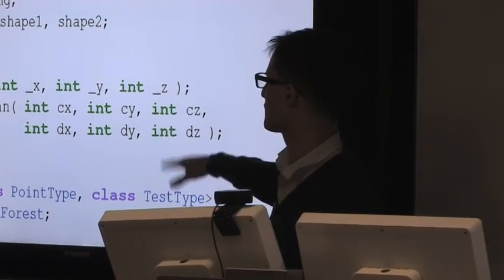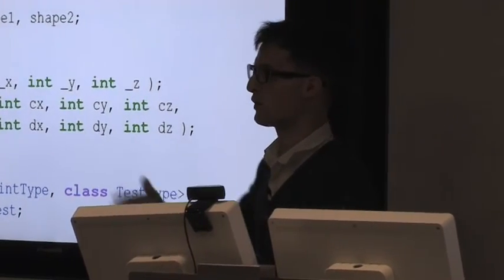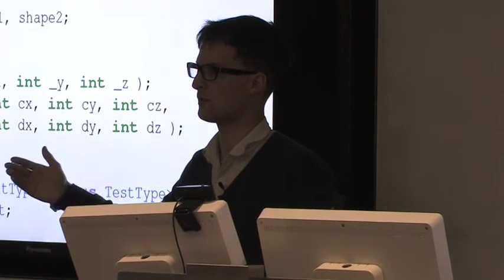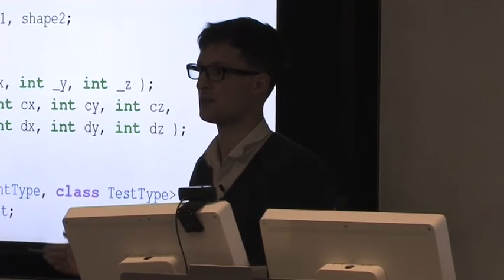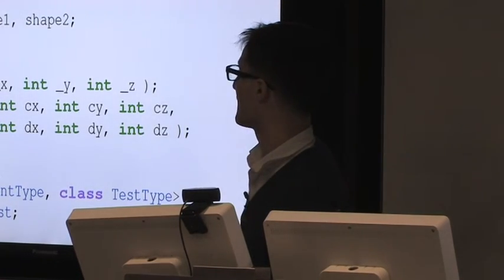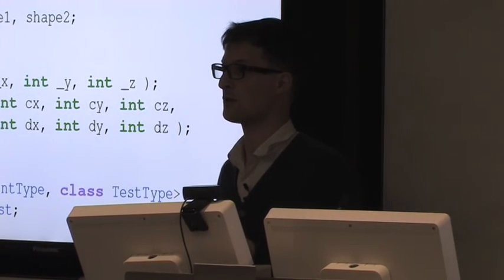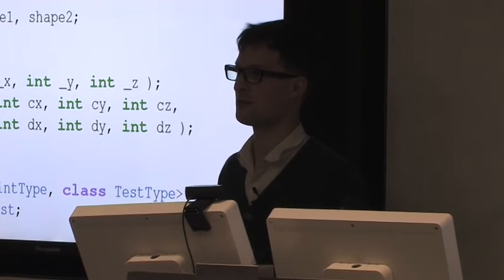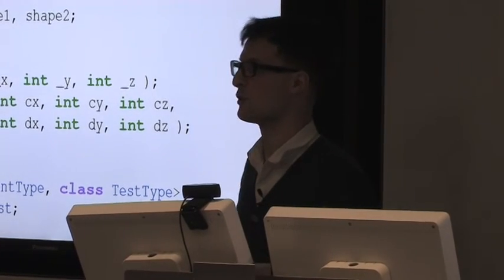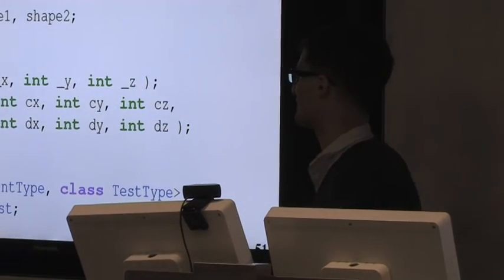With such an implementation, which I actually used in a different project, you can do your multi-threading over the slices of your 3D volume, because if you do your multi-threading over the pixels, you don't benefit from the actual multi-threading. And when you do start toying around with the multi-threading in Python, you end up with a lot of copying data into memory, duplicating objects into memory, and it's not that nice.